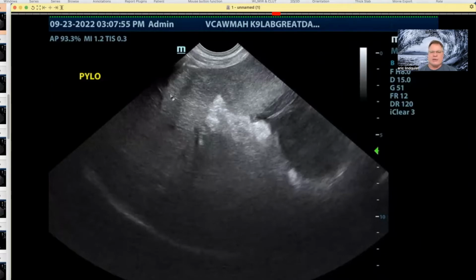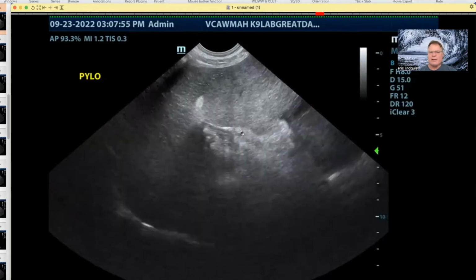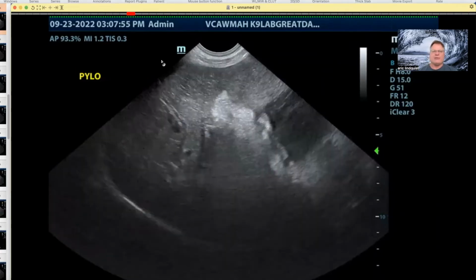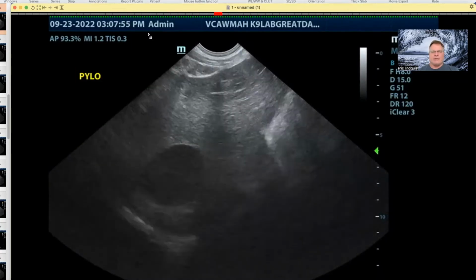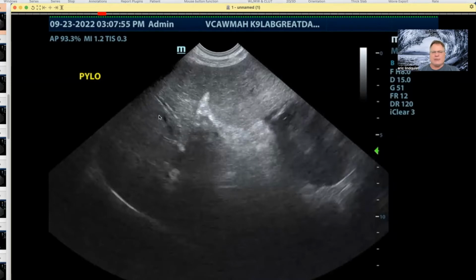Even though it looks in this view like it belongs to the liver, it's buttressing up against the spleen. But you can see that the splenic capsule clearly separates from the liver here. So it's all about following this capsule to see where the capsule goes around the mass, and therefore the mass belongs to the spleen. Obviously, we want to screen the liver for concurrent metastasis and not just nodular changes.